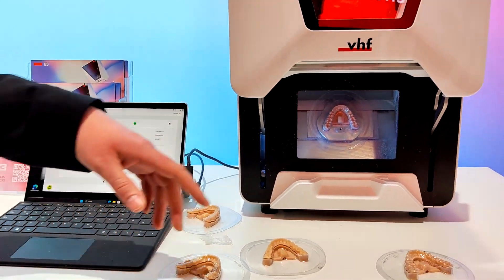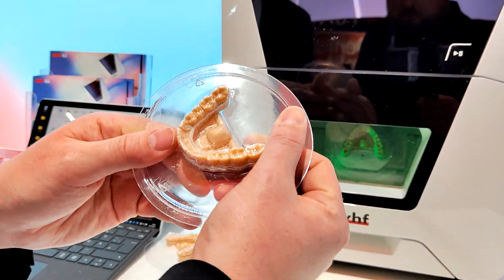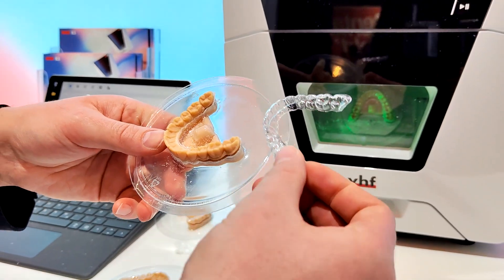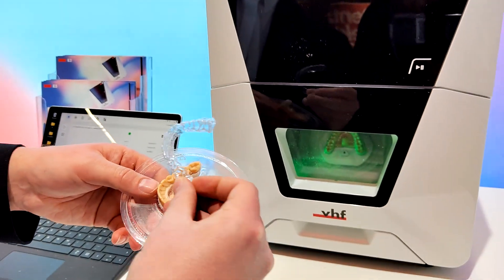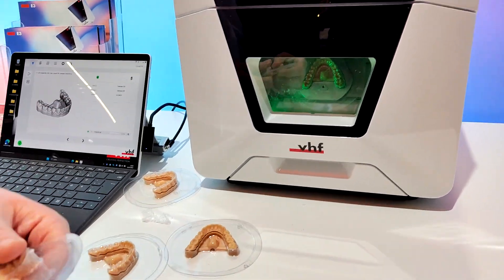In comparison, here is the E3. It trims aligners in about one minute — you put it in the machine after thermoforming and it mills it out in one minute. It's a nasty job to do by hand, so they digitalized it.